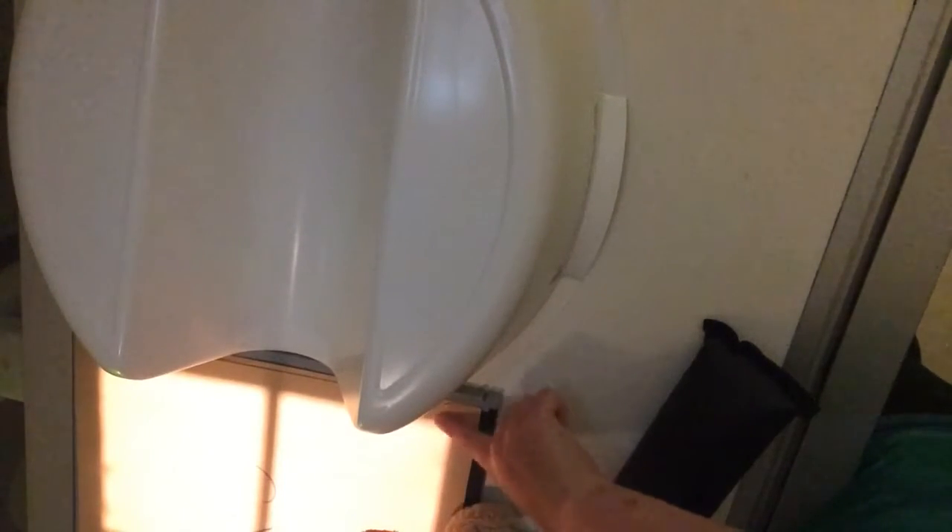Slightly odd here — I'm going to have to move the camera a little bit because we have got our trough, as we're going to do the hips. I would recommend having your trough set up like this, so you have your trough and your cassette right beside one another. I wouldn't recommend putting the cassette on the trough because it does push the patient away from the cassette, and it is very easy for you to collimate over the edge of the cassette and fail, so always remember to go inside.